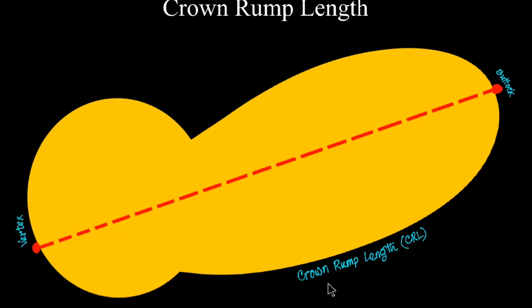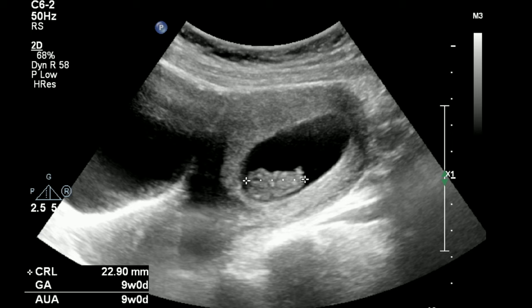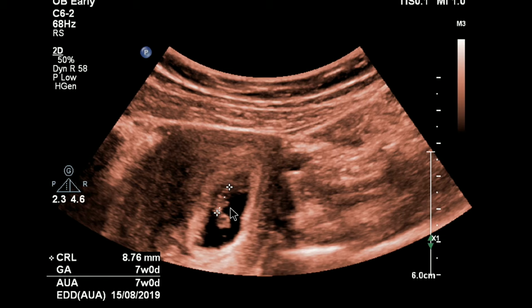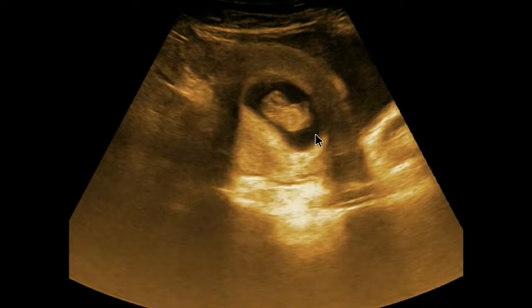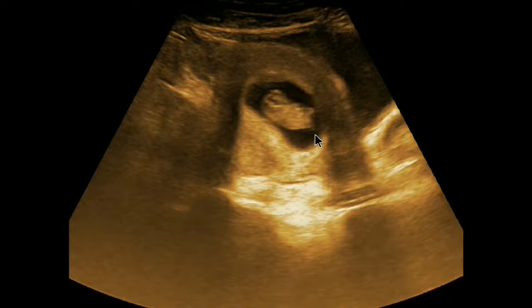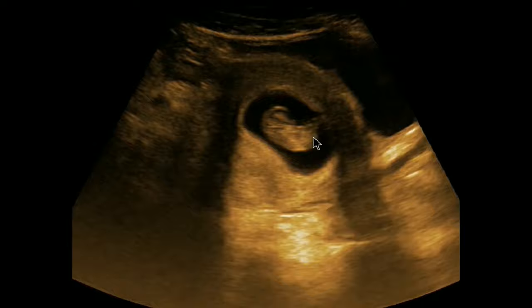Crown-rump length: crown means top of the head, rump means buttock. For crown-rump length, choose the CRL option and measure a distance from the upper limit of the cranium to the buttock or end of the abdominal part. Here we can see an embryo — this is the cranial part and this is the caudal part. You can also see a limb part. We are measuring from the vertex up to the buttock. Machine will show you the gestational age and EDD. Be careful about the yolk sac — do not include it mistakenly.